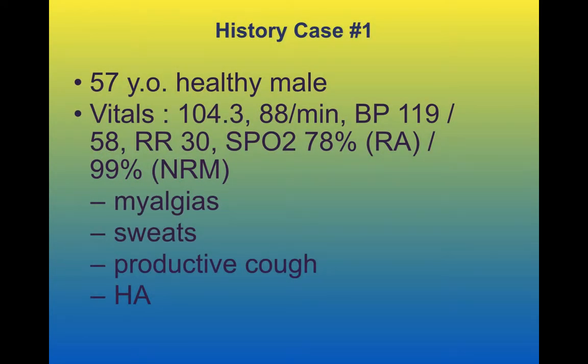Hey guys, in an effort to get out some more ultrasound education in a user-friendly format, we decided to do some clinical cases. This one today concerns lung ultrasound.